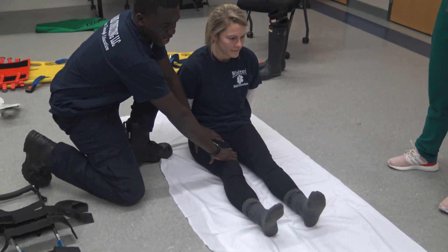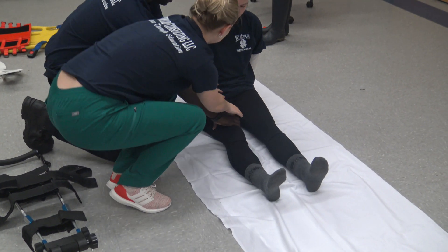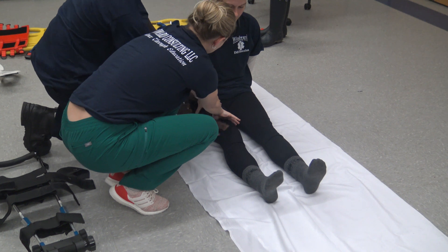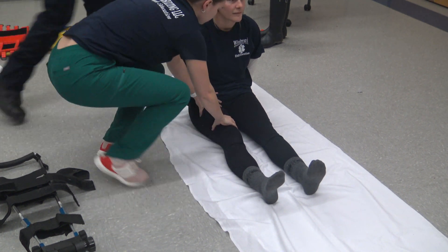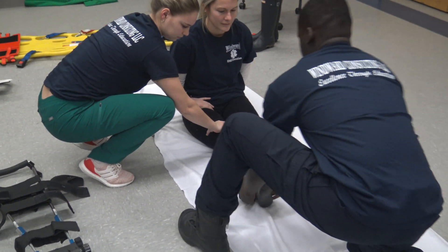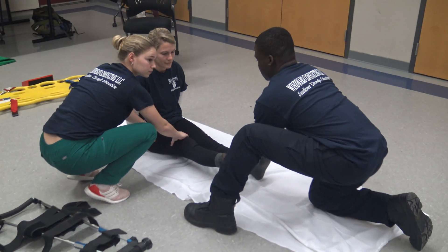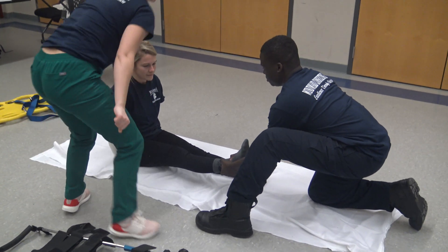At this point in time I'm going to hand it over to my partner. Now I'm going to move over here and I'm going to take manual traction of the injury. And at this point in time my partner is going to come and grab manual traction of the injury.